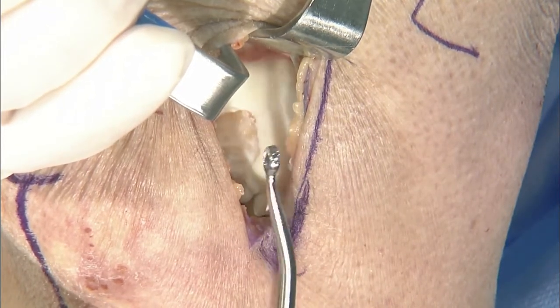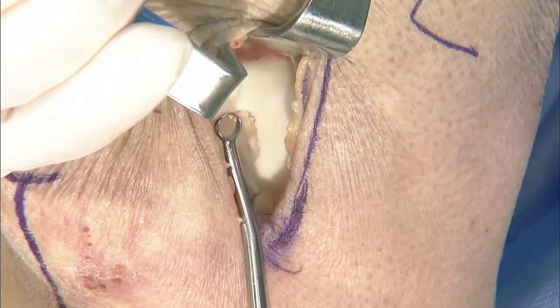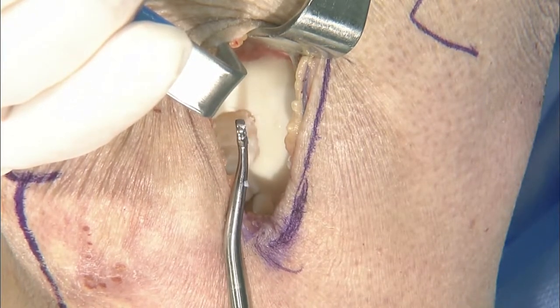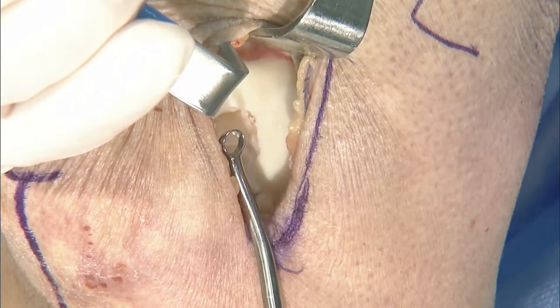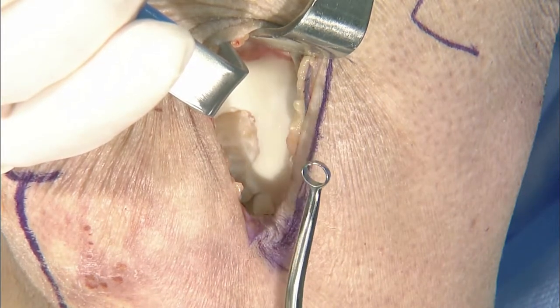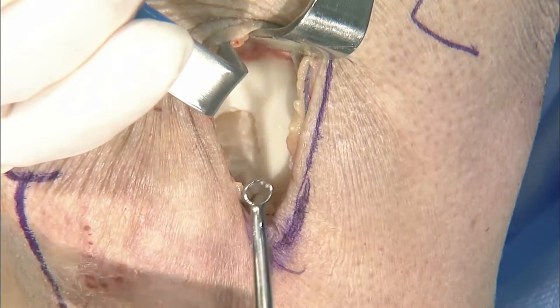I think the other thing that's really important is to really get to know your Arthrex rep, because not all ring curettes are created the same. A lot of surgery centers or hospitals will say, oh yeah, we have ring curettes or we have curettes. And you come in and you say, open up the ring curettes or open up the curettes for me. And you get something that's too big, too small, super dull, really not what you're looking for. And if you have the right tools, this is really easy. If you don't have the right tools, you just may not feel as good about it.